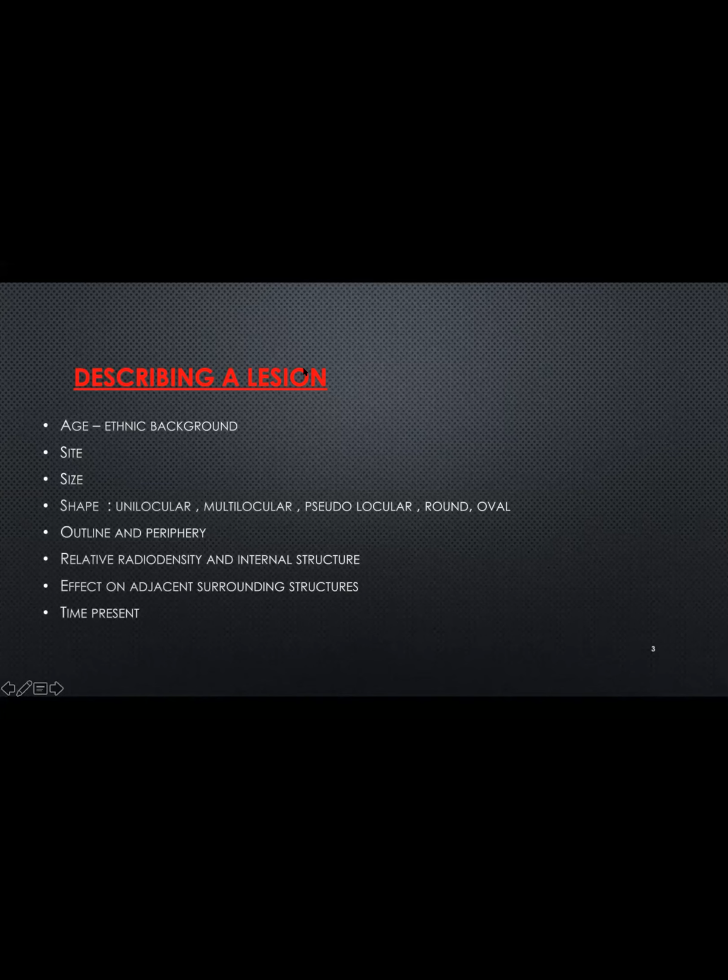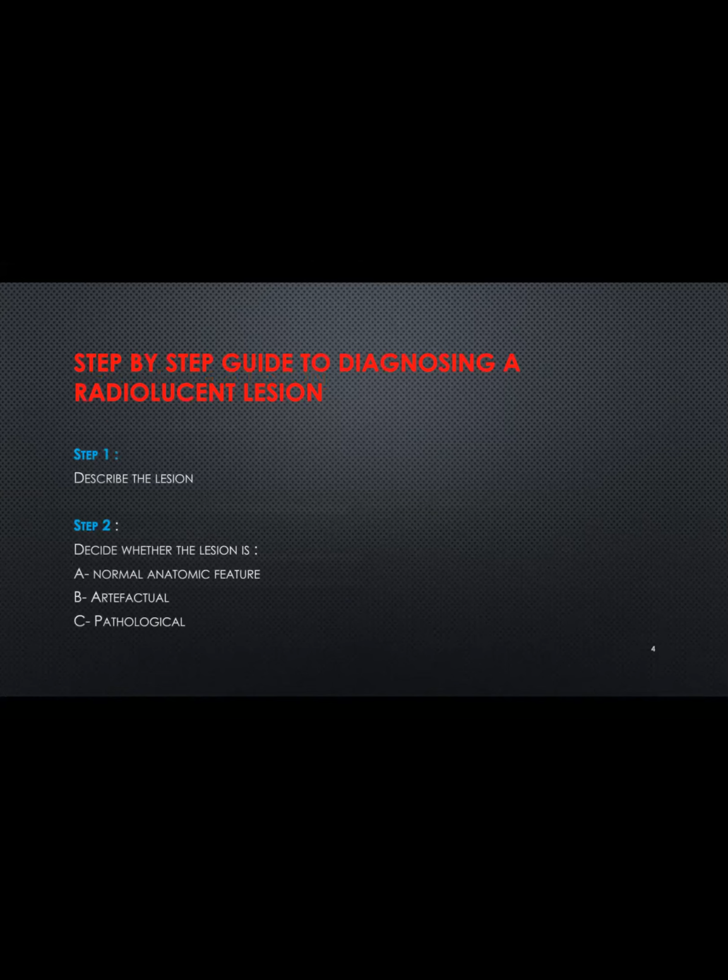Okay, so usually if we don't have a previous X-ray or sufficient medical history for the patient, we can't really compare, but it's also important. Now, there's a step-by-step guide to diagnosing a radiolucent lesion. So first of all, we have to describe the lesion, which was the previous slide.